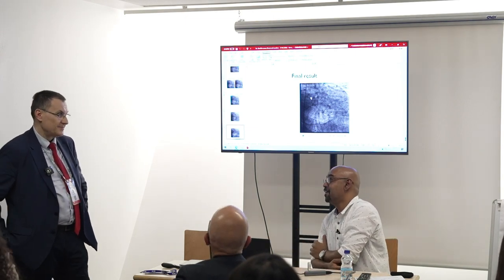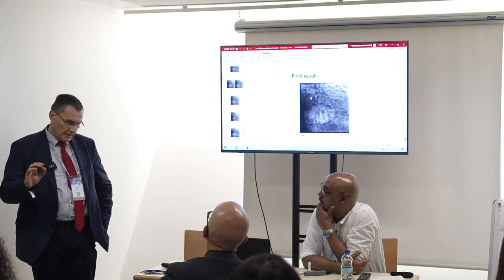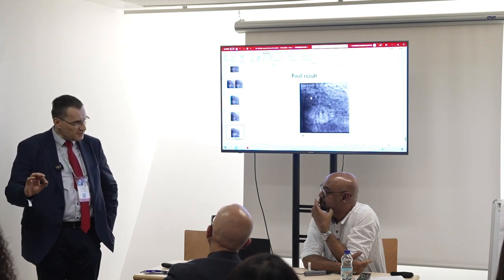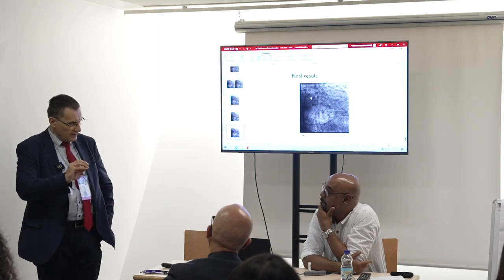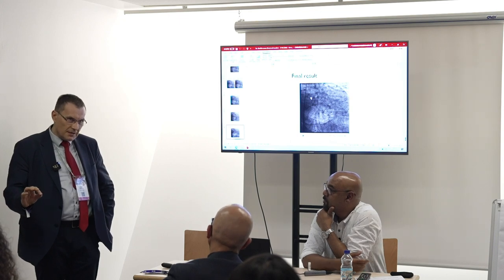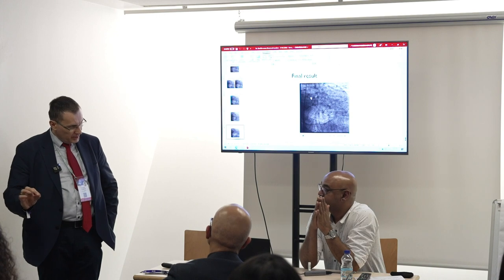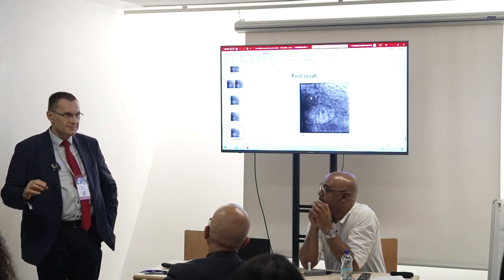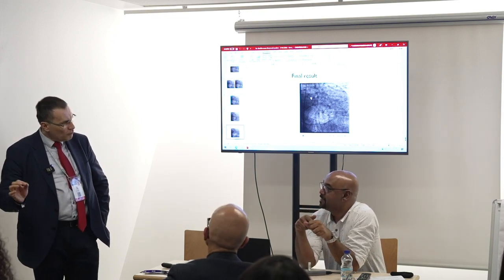Not too much. Yeah. Not too much. Usually if I cannot cross the lesion, I try several times with very small movements. I leave the burr at the ostium, the mouth of the lesion, and I start without too much pressure, but many times I just try to peck, not a big movement. Yes, pressure.